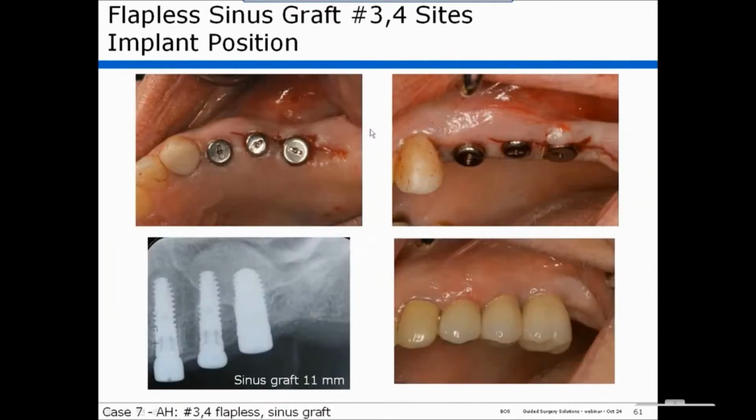What information would you need to receive for a fully edentulous upper case? A fully edentulous upper case? Yep. For a fully edentulous upper case, it would depend as to whether it was going to be an implant-borne prosthesis or an overdenture. If it were an overdenture, we would need a model of the edentulous arch and a cone beam scan of the arch. If it were a case where it was going to be implant-supported fixed bridge work, then we would need a scan of the patient wearing the denture and a scan of the denture.